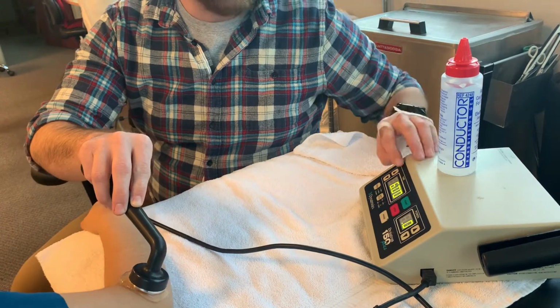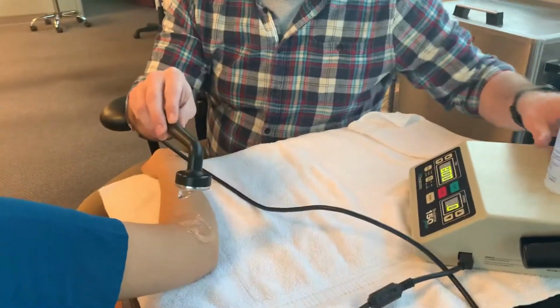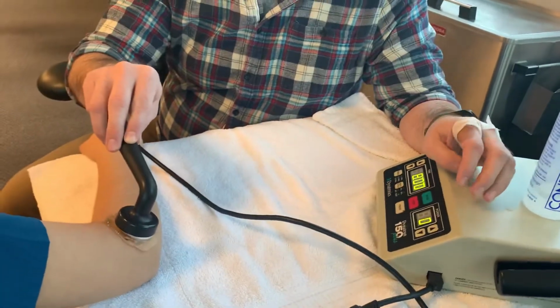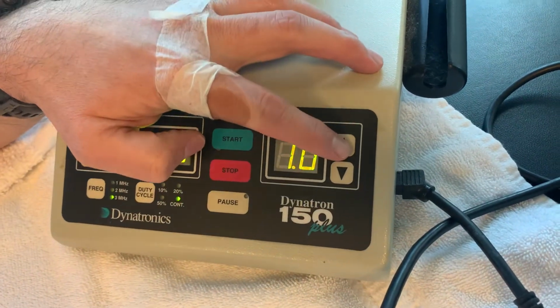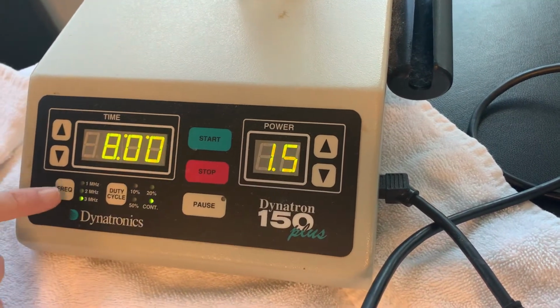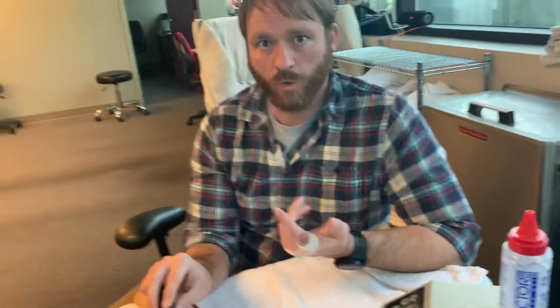I'm going to use the treatment time of 8 minutes, and that's what most of the research is done on, mostly because that's the minimum amount that Medicare would pay for. But that has been shown to be effective in the research, so we're going to do a 3 megahertz because it is a relatively superficial site. Let's say we're going for a thermal effect. With a 3 megahertz, you are going to get more heating with a lower wattage than you will with a 1 megahertz. Because when we're talking about the frequency here, a higher frequency equals more vibration, that equals more heat.